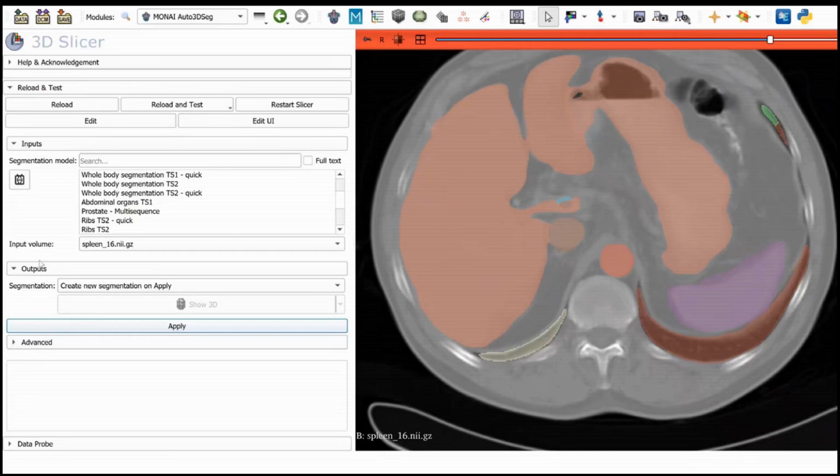Yes. So mostly, there are two use cases that I think are worthy to mention. One is the MONAI Label Reviewer, which is basically a layer that was created by Charité University Hospital in Berlin. That's one of the big contributions, but mostly models or data sets. So people say, I'm using this data set, I'm using MONAI Label to train the model. So they basically make the model available to MONAI Label and people can use it. But yeah, mostly NVIDIA and KCL are at the core of MONAI Label.